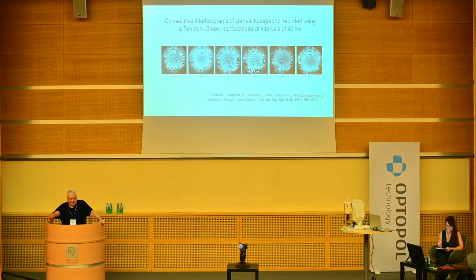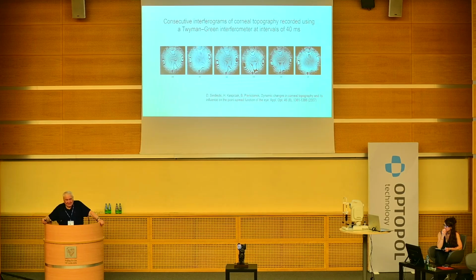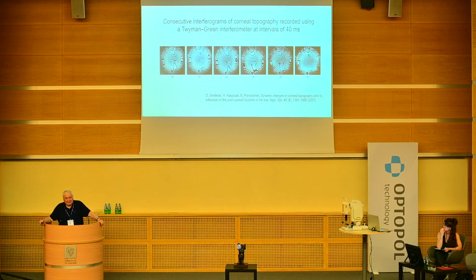This approach is very sensitive, but what is bad with this, when you do something sensitive, you may think about how it is sensitive not only to the useful information, but also to the information that is interfering.